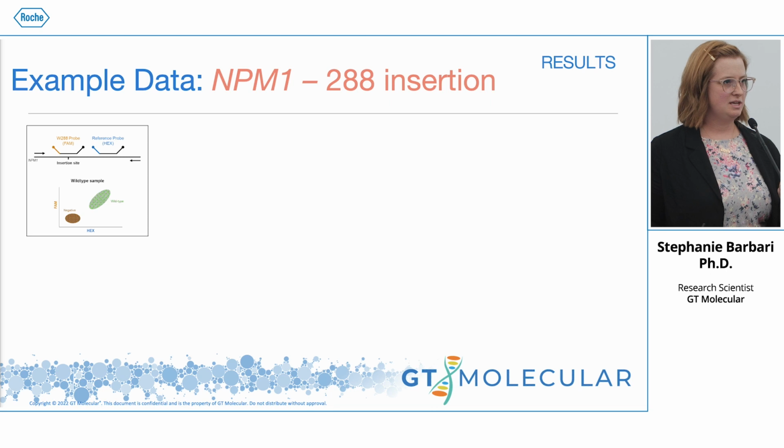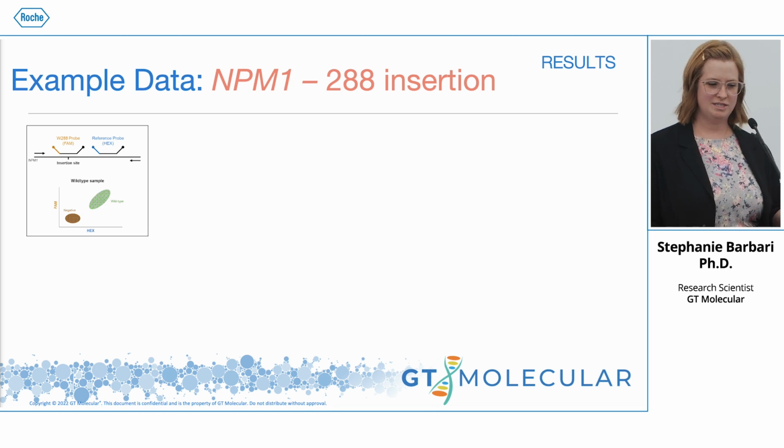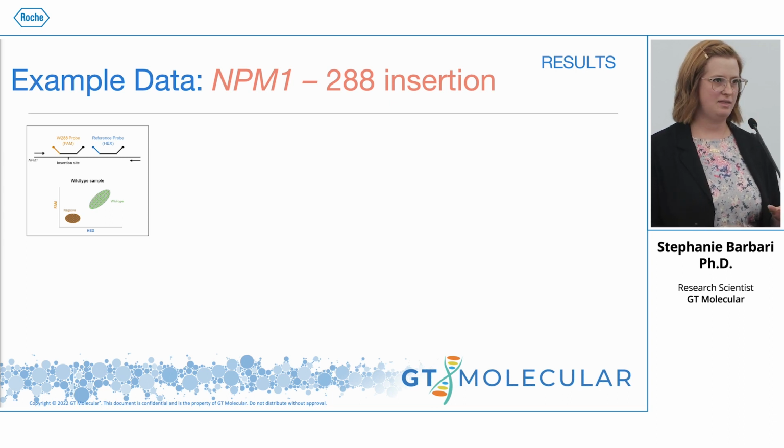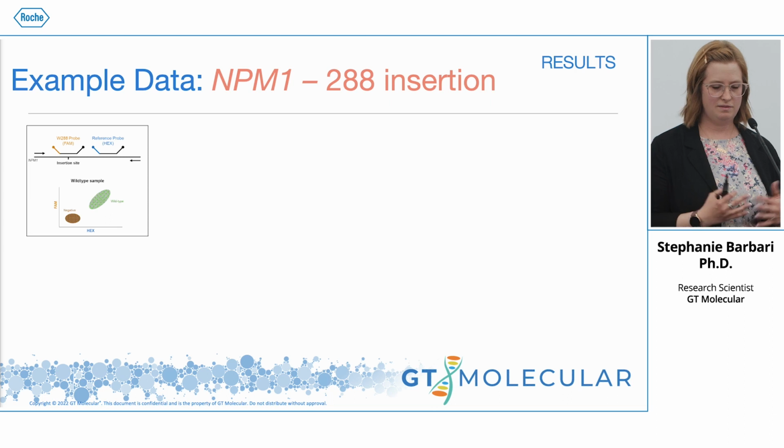And as I mentioned, NPM1 insertions are always 4 nucleotides at the same site, but those 4 nucleotides can vary among patients. So in order to develop an assay that will detect pretty much any insertion that occurs in one reaction, we developed a drop-off approach.